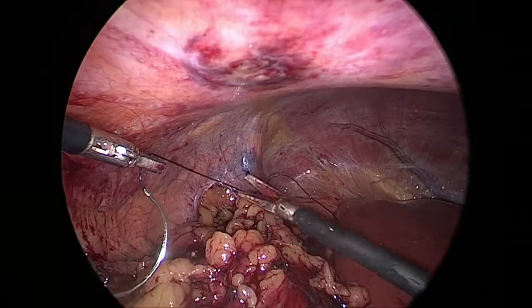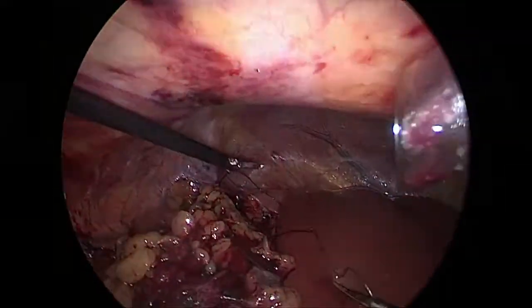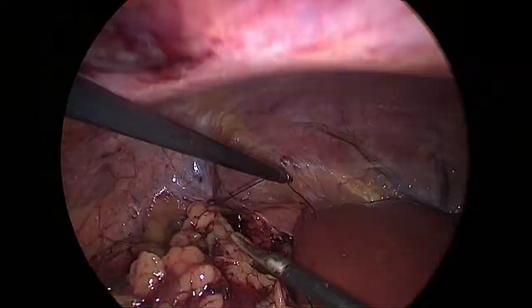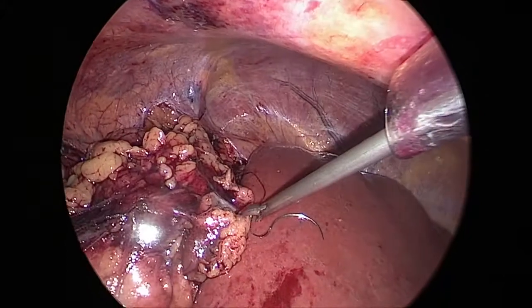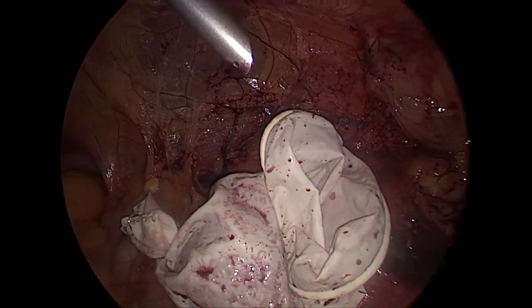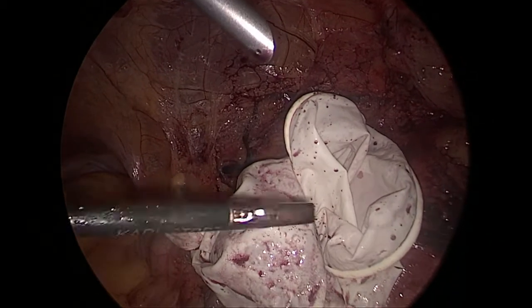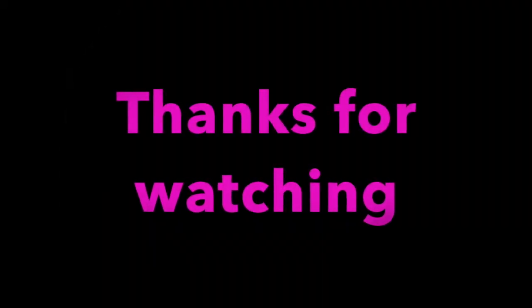We removed all gauze pieces, needles and bulldogs. Then the specimen, slightly enlarging our camera port, putting a drain in the renal bed.